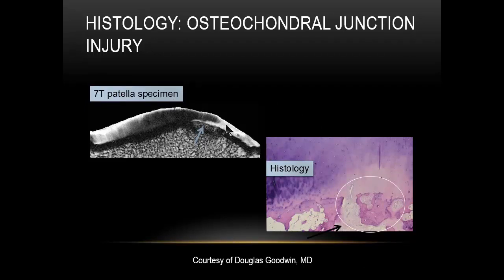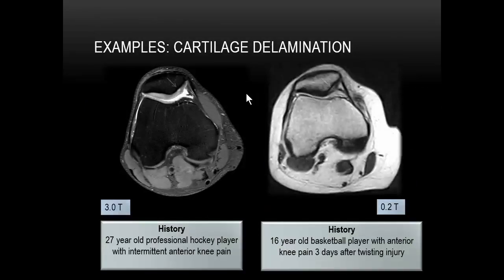So when these surfaces are intact, I think they have lower clinical significance. Unlike the prior study we saw, which was communicating with the overlying articular surface. I think those are more indicative of unstable chondral type lesions.